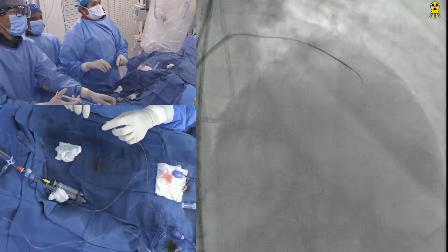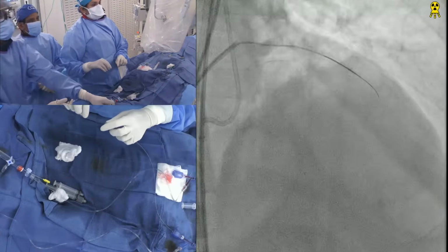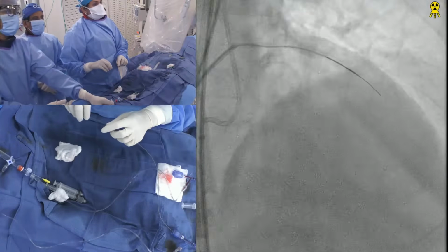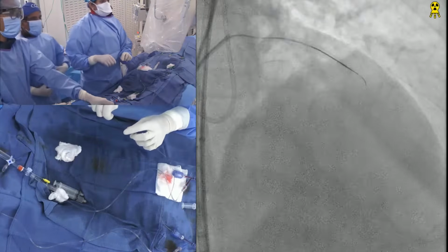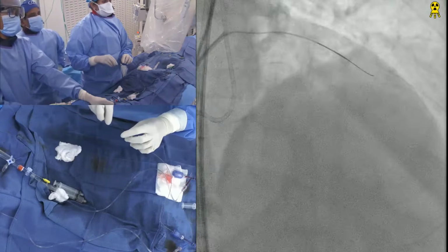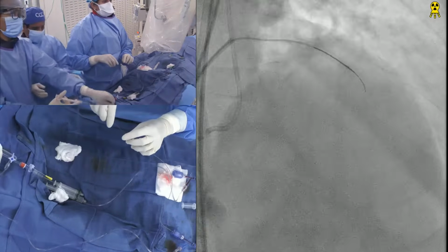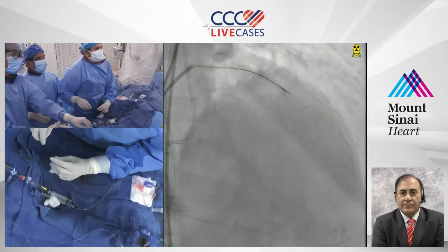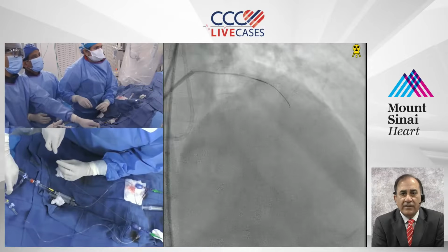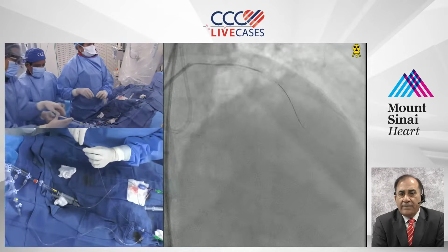So Anu, is this the same Fine Cross? No, this is Corsair 150. This is Corsair 150 because you are applying the retrograde. Got it. Yeah, that is where we use the Corsair. Previously, I've noticed for the retrograde, in the diagonal, it comes back too far. Yep, I'll take it.